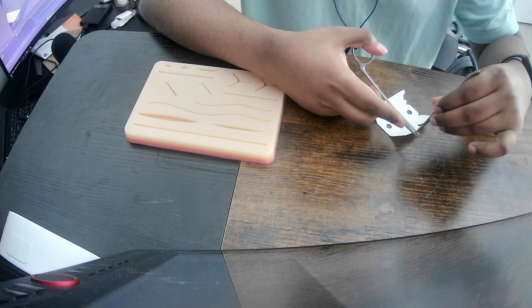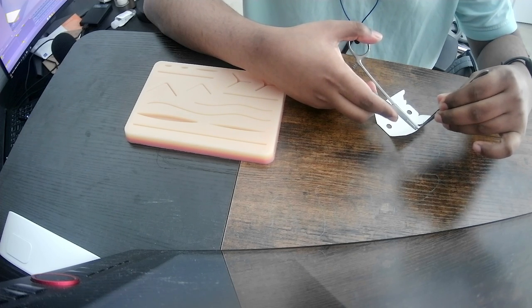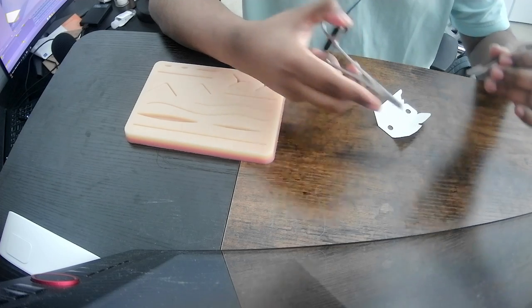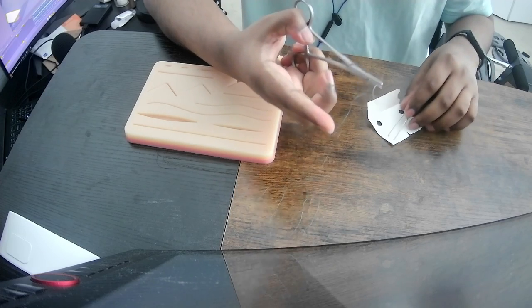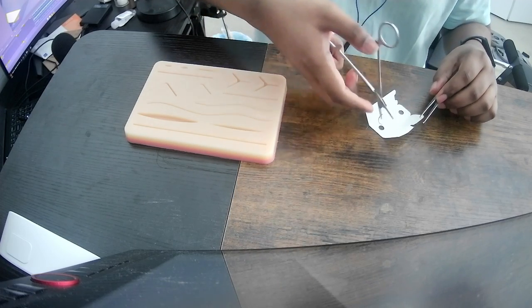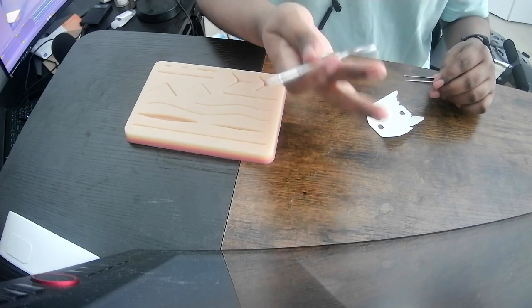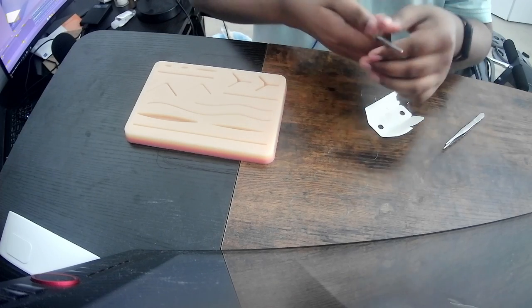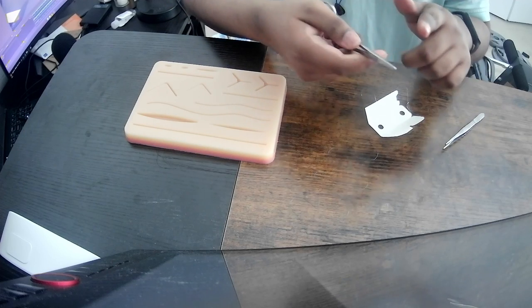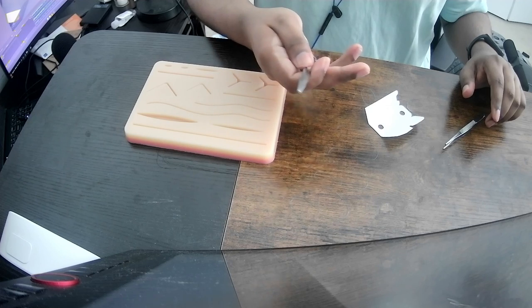And basically, all you do is you hold it with your forceps in your offhand, you open up the needle driver, in the way that we discussed, and you just load it at the tip. Oh, no. Like so. I messed up. And then you lock it into place. Yeah, for some reason, I couldn't lock it in. Important that you put it on the tip. Interesting. For some reason, I couldn't lock it. Once I was holding it, once I was driving it, I wasn't expecting the resistance when locking in.